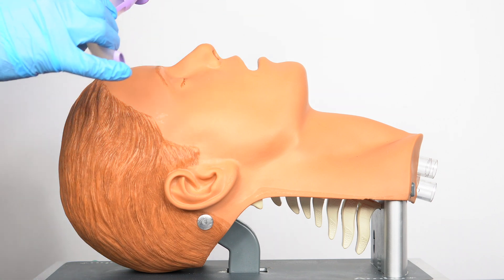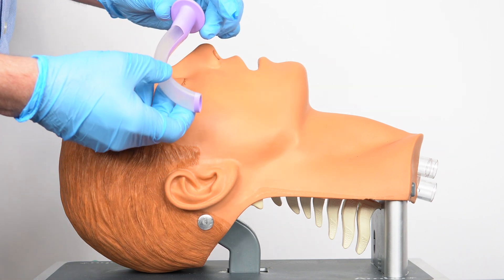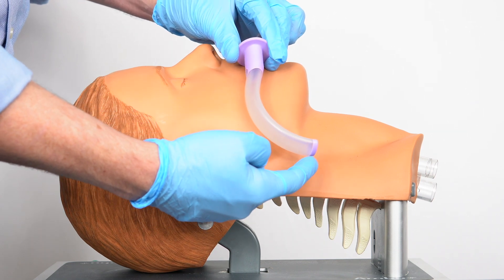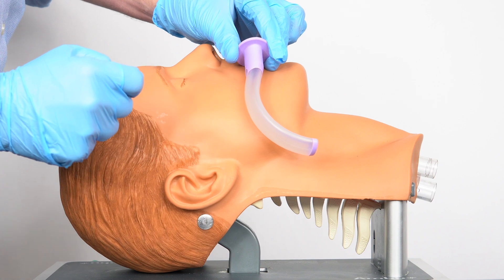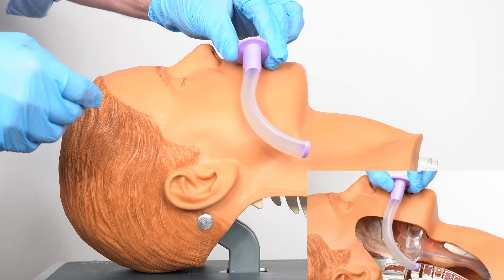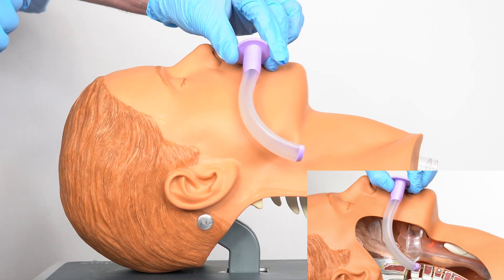If I've tried this airway it already looks like it may be too big, but I can check by lining the flange up with the incisors — and the tip of the airway is a long way from the angle of the mandible. So this is going to be too big and potentially would cause problems with the patient's gag reflex or cause them to vomit.